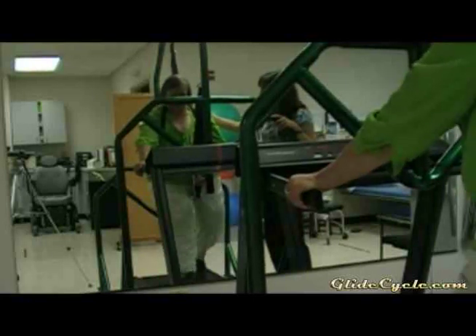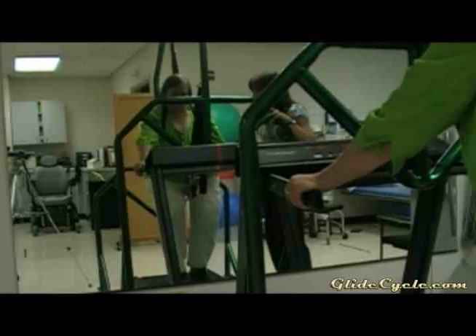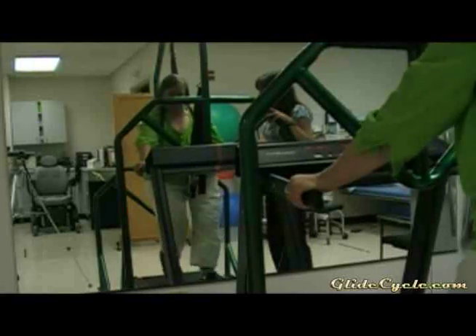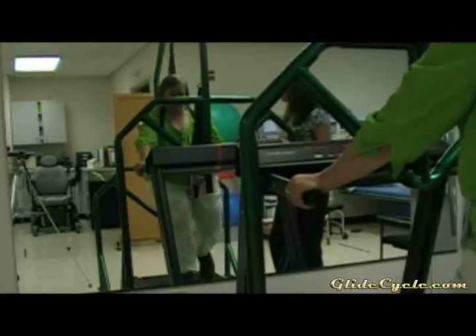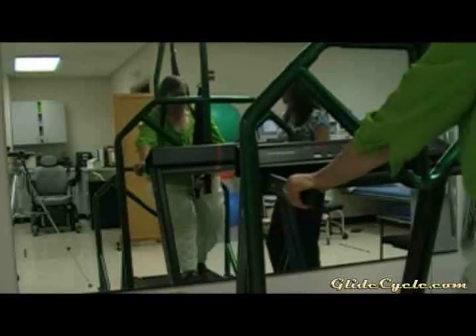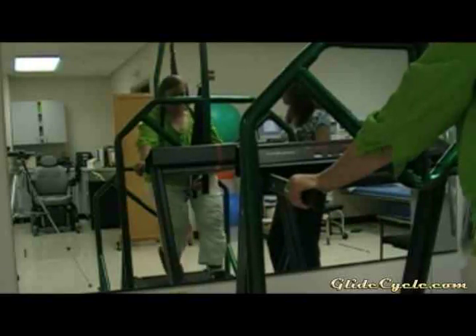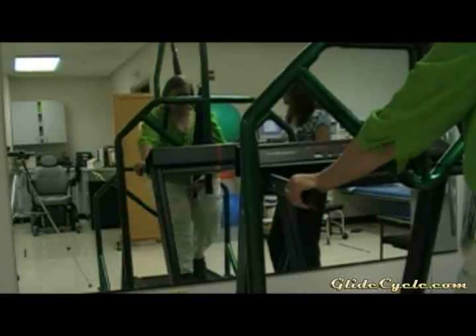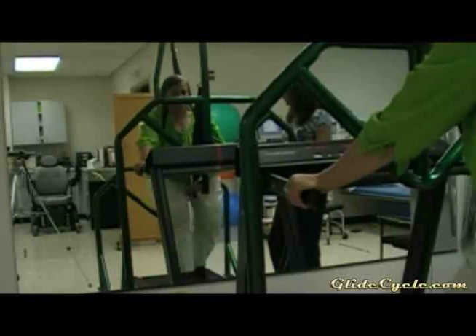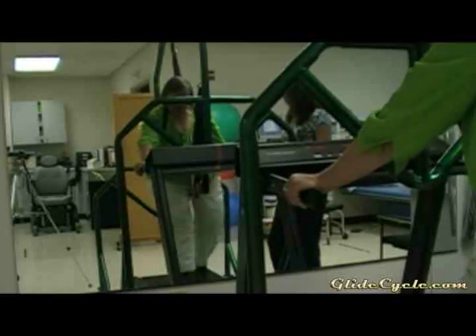After you do this for a little while, you'll probably feel, as you get closer to two, three, four miles an hour, your heart rate will go up quite a bit. What does this feel like to do instead of walking? Well, it feels easier for me than walking because in walking I am weight-bearing, and this allows me to move without being concerned about falling or tripping or any of the other things that I normally feel.